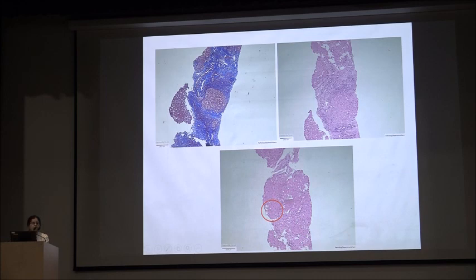So definitely this is not qualifying up to 5% steatosis. If we go by definition, we cannot call it associated with NASH or because of MAFLD. So in these scenarios, these recommendations come into play, that if there is a prior biopsy documentation of MAFLD or demonstration of steatosis by imaging, such cases can still be called due to MAFLD.